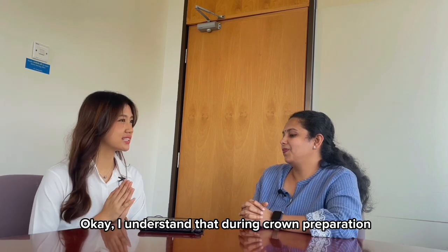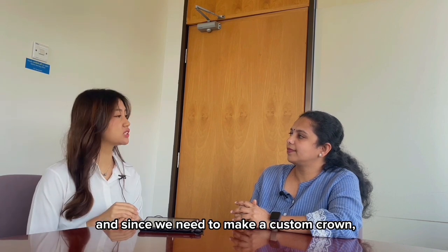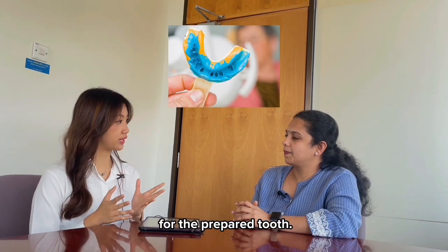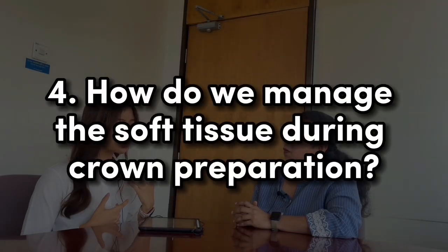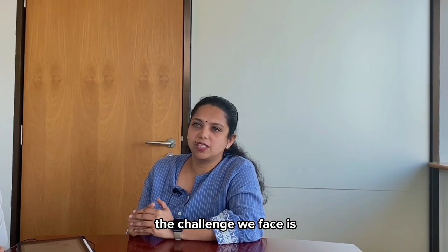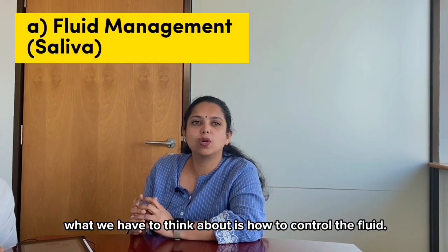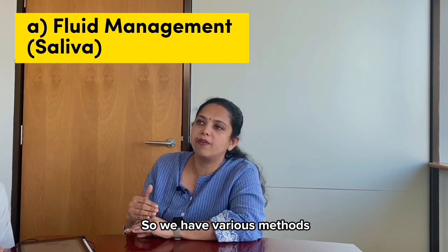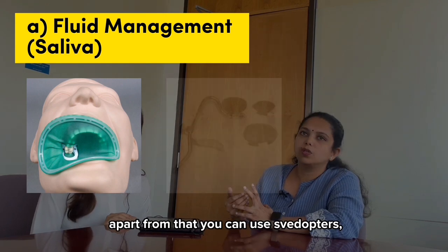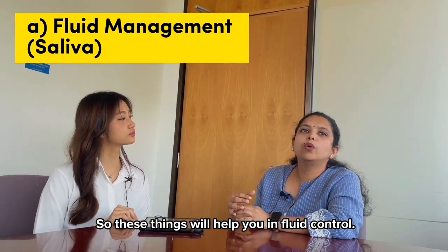During crown preparation, we need to shape the gingiva for a better fit, and we need the best impression for the prepared tooth. How do we manage soft tissue during crown preparation? The challenge we face first is fluid — saliva. We have various methods for controlling it, such as rubber dam application. Apart from that, you can use saliva ejectors or high- and low-volume suctions. These will help in fluid control.